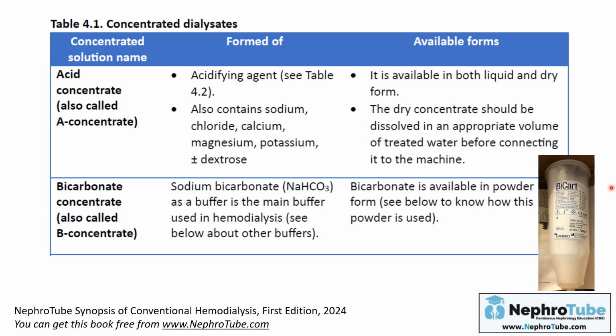It is important to know that the manual preparation of bicarbonate, whatever the method, can lead to bacterial contamination, as bacteria thrive in this type of environment. That's why it is important that any bicarbonate solution that has been prepared, not the one in the pre-filled cartridge, I am talking about the bicarbonate prepared in the hemodialysis units, must not be left unused for a prolonged time, for more than 4 hours.